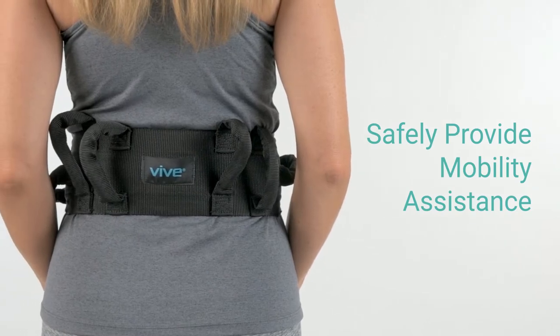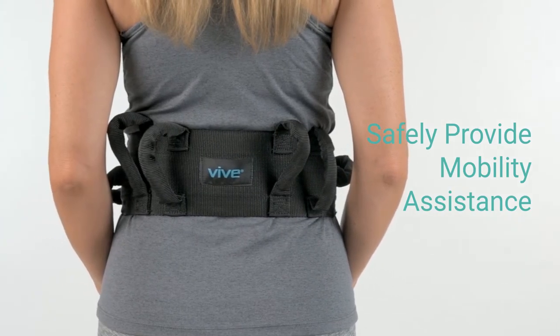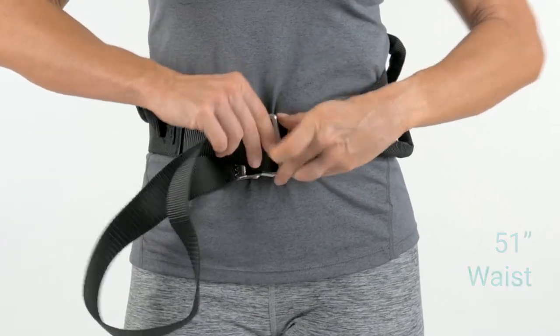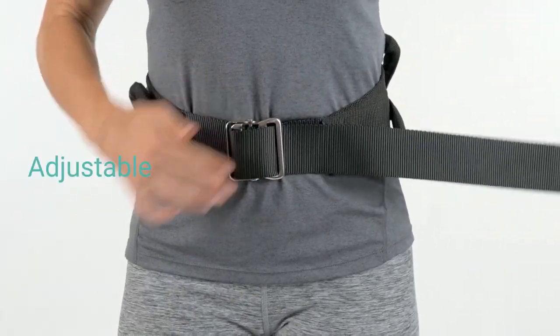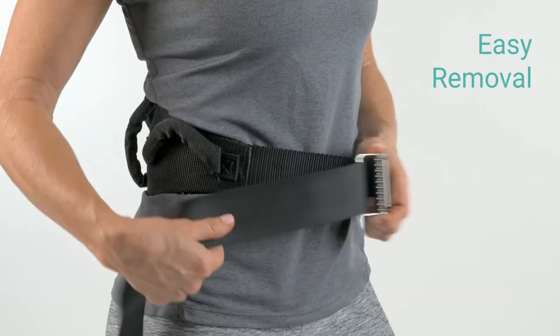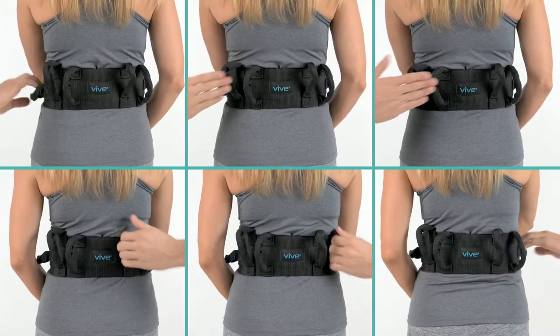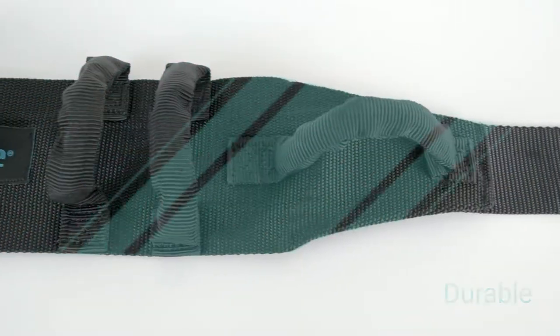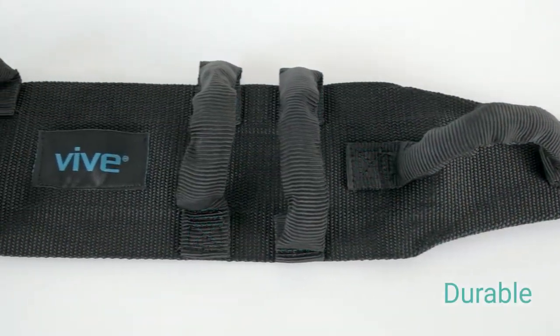The Transfer Belt VI-VI allows you to safely and effectively provide mobility assistance. Accommodating waist up to 51 inches, the adjustable belt features a metal buckle with locking teeth and a quick-release latch for easy removal. Six padded handles allow support from any side or angle. Strong nylon webbing and reinforced stitching provide exceptional durability.